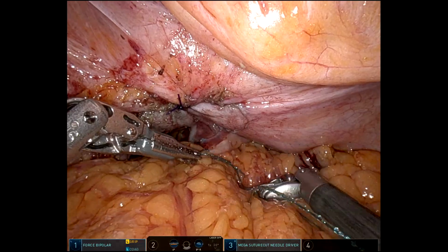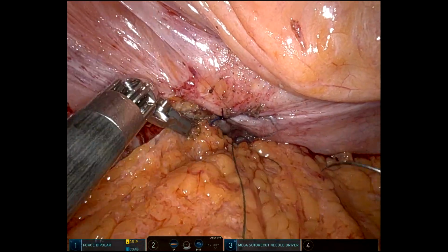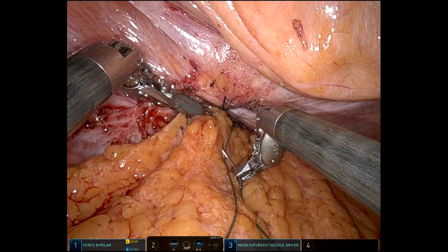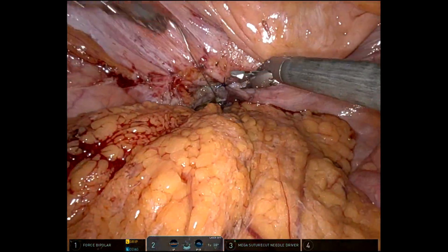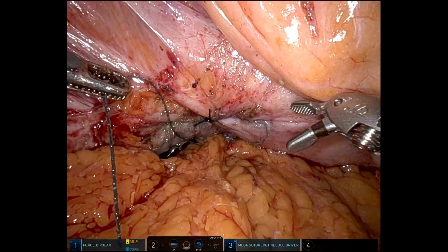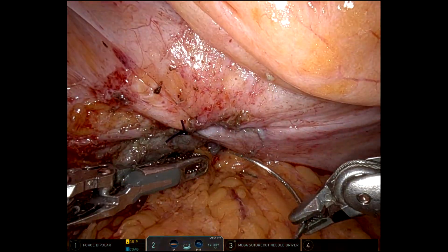But I will mobilize the omentum up off of the transverse colon on the left or the right, preserving an arcade pedicle for the blood supply, to do what you're seeing me do here. So this is going to completely interpose the space between the anastomosis and the bladder repair.